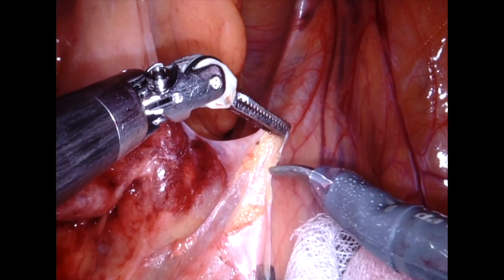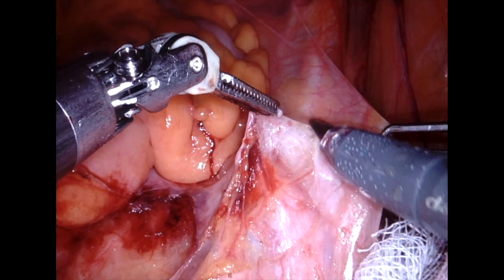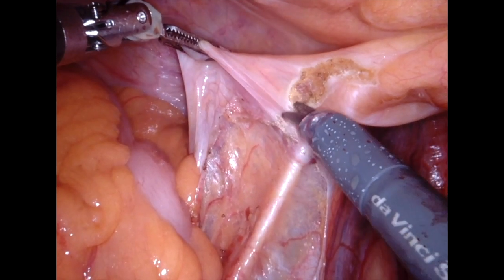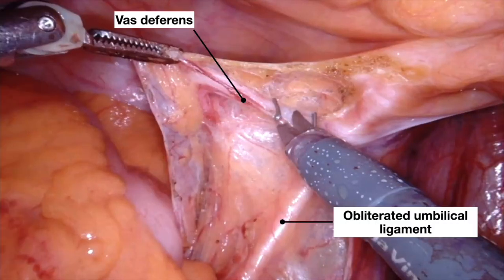The peritoneal cut is extended laterally onto the right side and towards the obliterated umbilical ligament. The right side vas deferens comes into view, which is then clipped and divided.